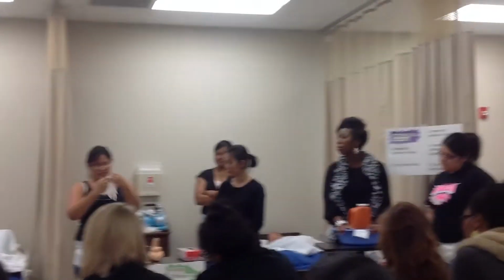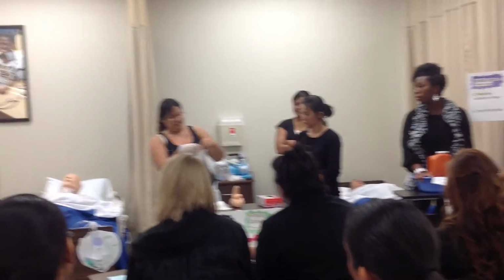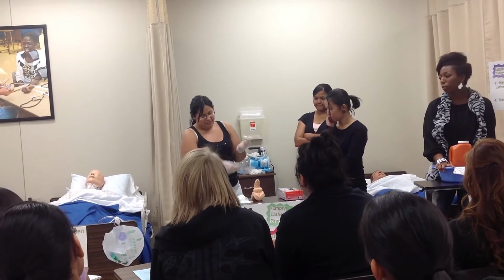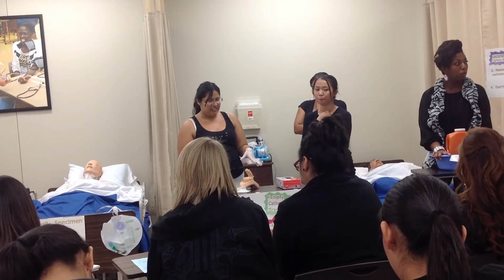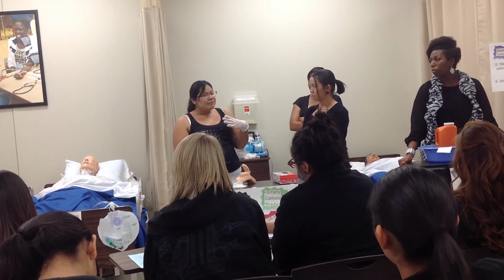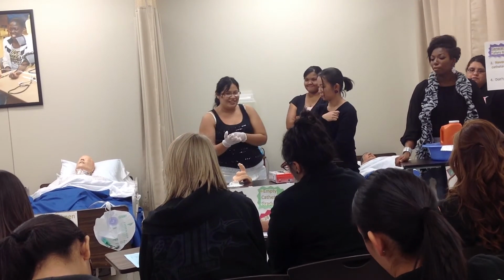But you're gonna come in, wash your hands, do patient identification, policy procedures, all that good stuff we learned earlier. Put on your gloves, because I don't think anyone wants to be touching anything without gloves on. Then you're gonna assess the skin. You're gonna make sure that it's not irritated or anything. If it's irritated, you're not gonna want to put the condom catheter on, because although it is like a condom, this has adhesive on it, and that would irritate it a lot more.